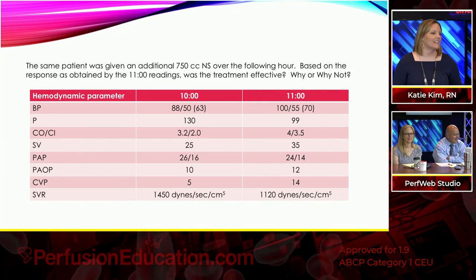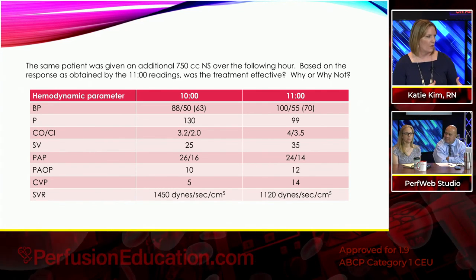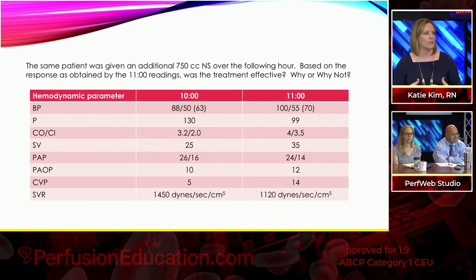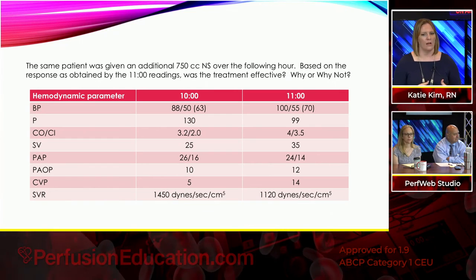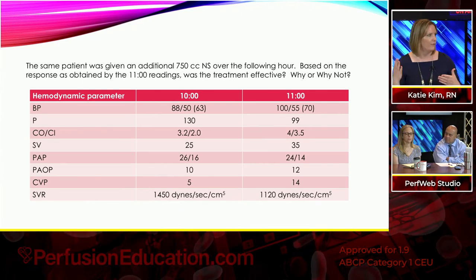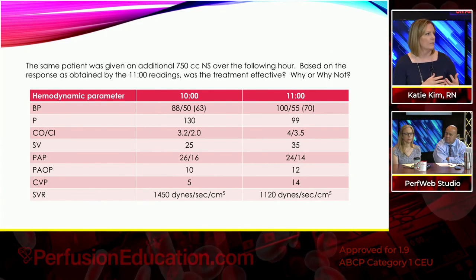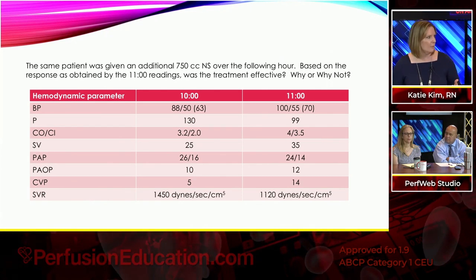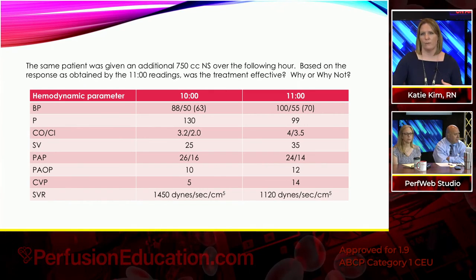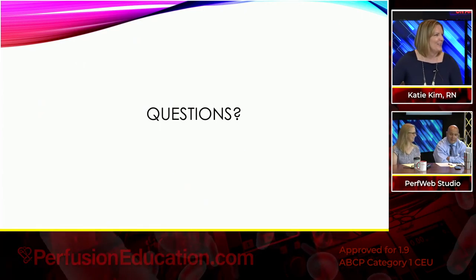So that's exactly how you use your knowledge of what's normal and what's abnormal to guide treatment, and you see what the trend looks like. We're not always going to take one set of numbers and say we've fixed him. We're going to look at the total picture, and we're going to use what we know to be normal to treat what's abnormal. That makes sense. Makes a lot of sense. So with that, I might have gone a little fast. A little, but that's okay.